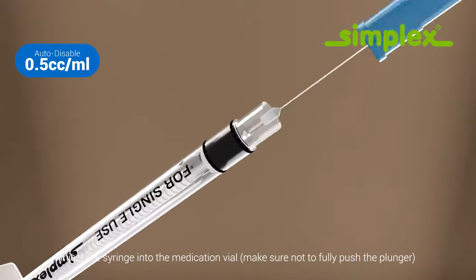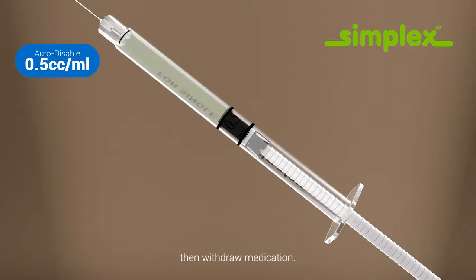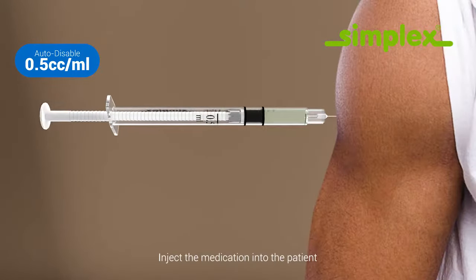Inject the syringe into the medication vial, make sure not to fully push the plunger, then withdraw medication. Inject the medication into the patient.